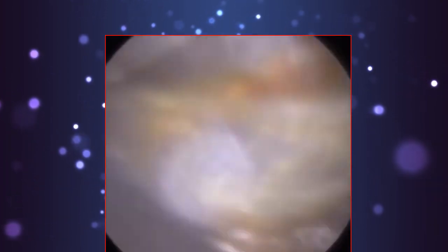You'll just put a bit more drops in just to lubricate this. The drops not only bind the wax together and stop the suction probe from getting blocked, but it's like if you've got a ring stuck on your finger and you put a bit of soap around it, it helps you loosen the ring off your finger. And sometimes oil does that as well. When there's a tight space and a bit of friction, the oil just helps to lubricate that area and to bring the wax forwards.